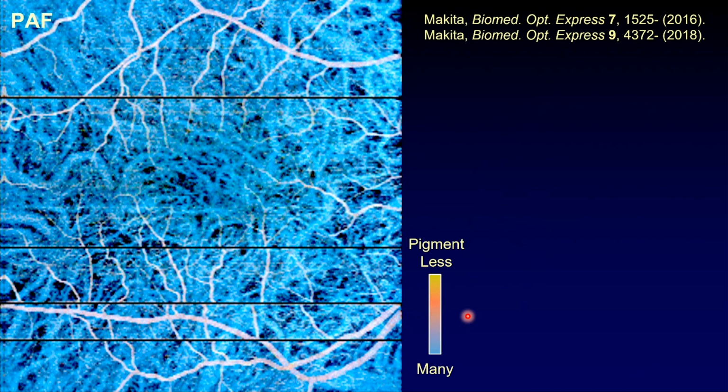By watching this volume from the top, we can have this enhanced image. Okay, so as you can see, this one is a normal retina, and there is a blood vessel here, and there is another blood vessel. These blood vessels in hot colors, from yellow to red, are retinal blood vessels. They appear yellow because there is no melanin on top, right?